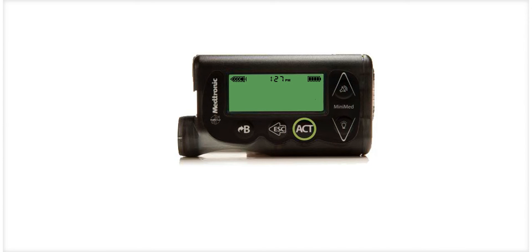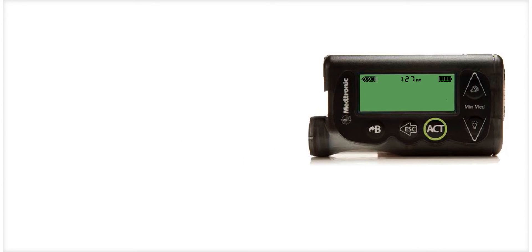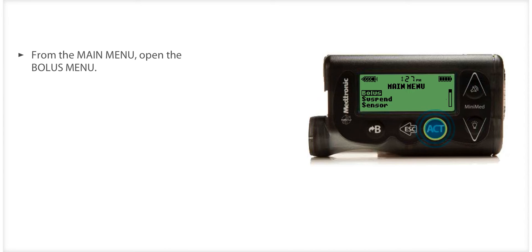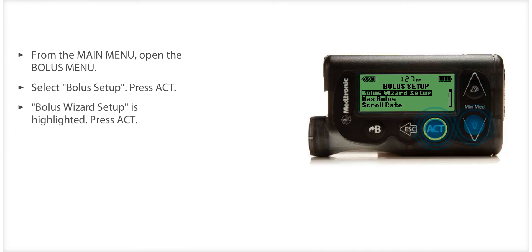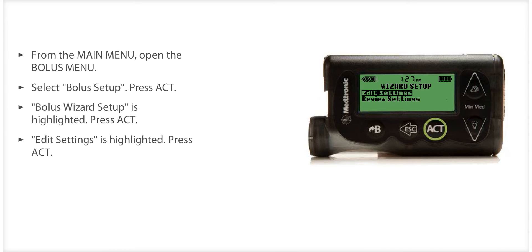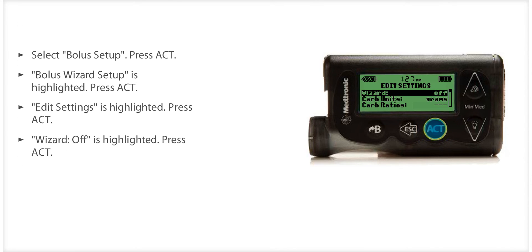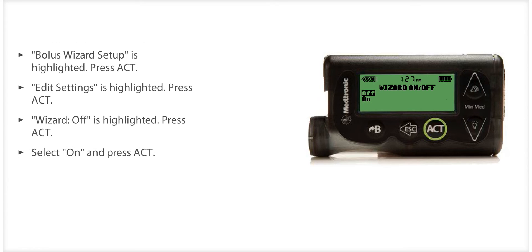The pump ships to you from the factory with the bolus wizard feature turned off. To turn the bolus wizard feature on, press ACT to open the main menu. Bolus is highlighted. Press ACT to open the bolus menu. Select Bolus Setup and press ACT. Bolus Wizard Setup is highlighted. Press ACT. Edit Settings is highlighted. Press ACT again to select Wizard, select ON, and press ACT.